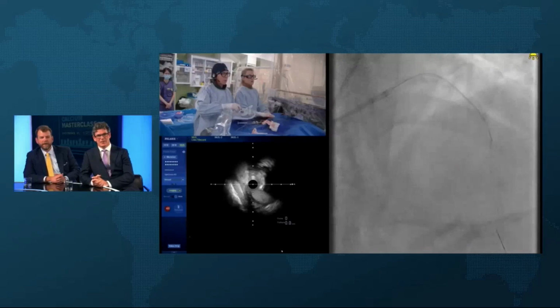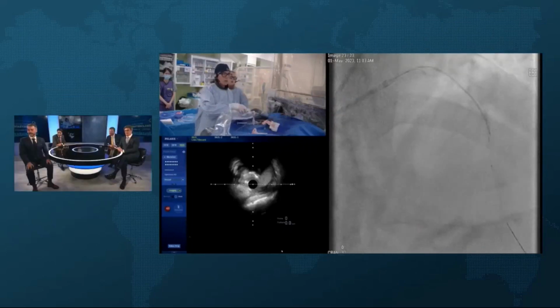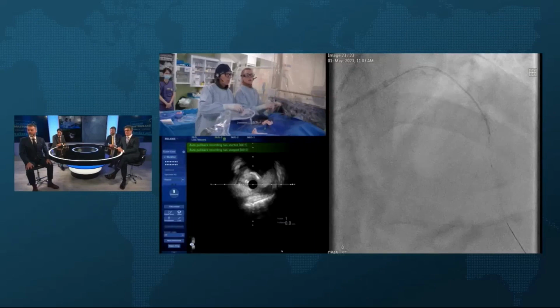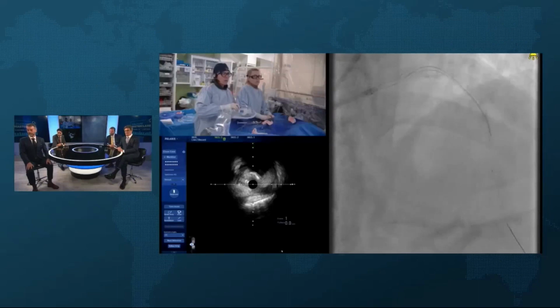The deformability. Yeah. Just a little bit beyond there would be nice if you could just show us the landing zone beyond. Okay, see if you can go a tiny bit further. Yeah, we're just at the edge of that nodule.